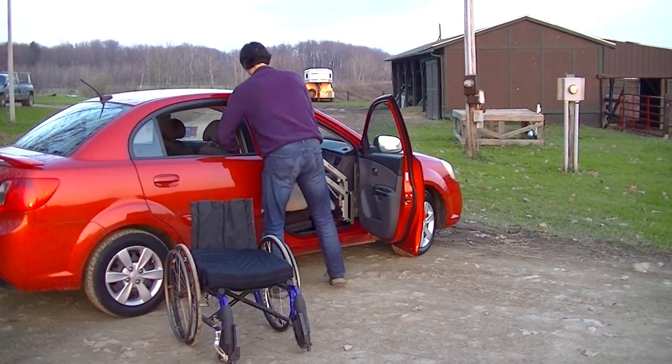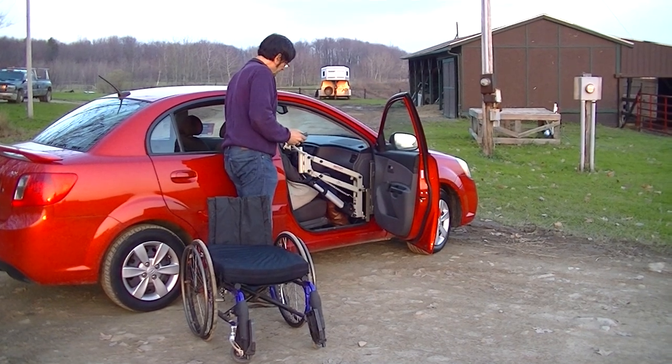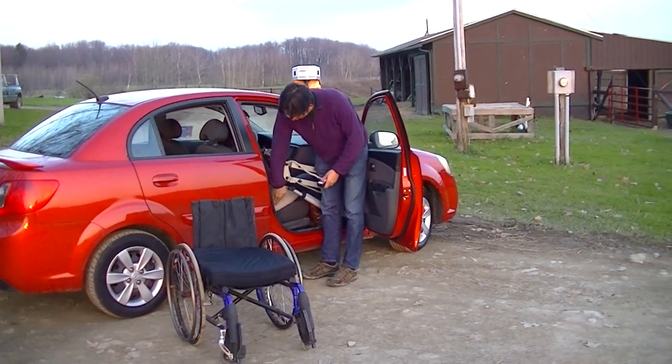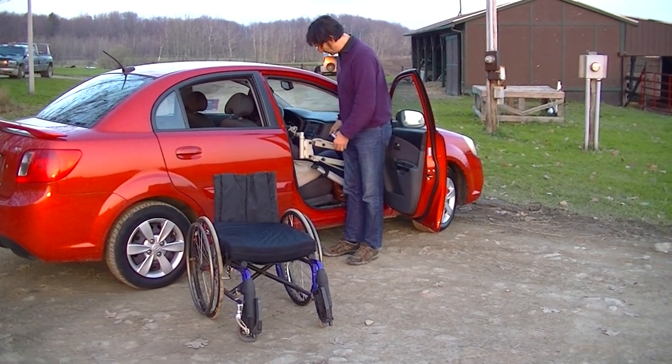Once we're in an appropriate position, a little bit of pressure back here allows us to get good clearance into the vehicle, and drop down for an easy transfer. When done properly, the back is all the way pushed up, and the small of the back is pushed up against the bottom of the seat back, allowing for a nice, comfortable ride.